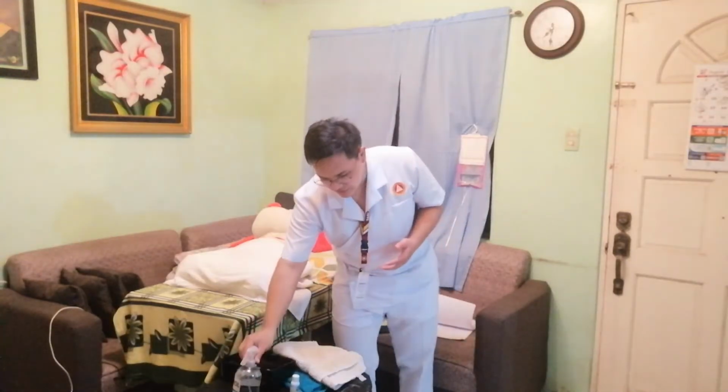So for our next step, now that we got the patient's consent, we will now proceed to our next step, which is we need to perform hand hygiene, and we need to observe other infection control procedures. Okay? So for example, that I have upon entering the patient's room, I have already washed my hand. Now I will be just spraying my hands with an alcohol solution. Okay?